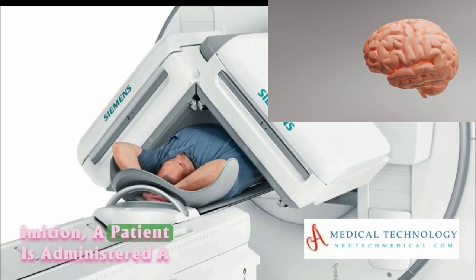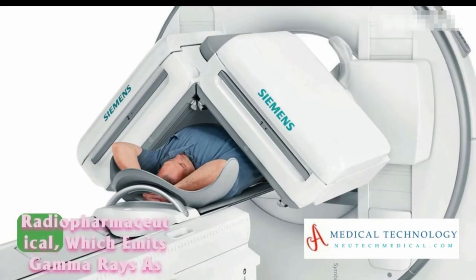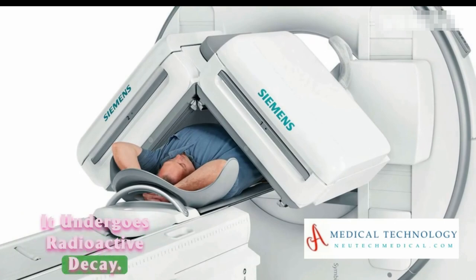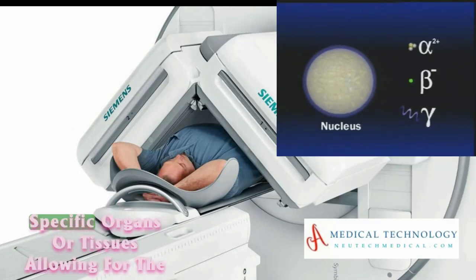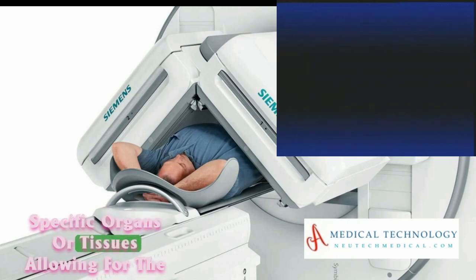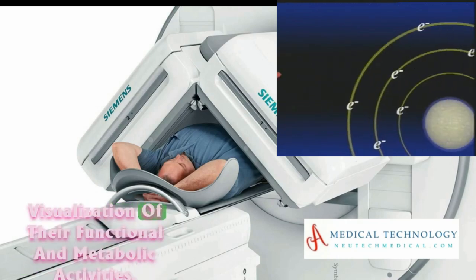Gamma ray emission: A patient is administered a radiopharmaceutical which emits gamma rays as it undergoes radioactive decay. The radiopharmaceutical is typically designed to target specific organs or tissues, allowing for the visualization of their functional and metabolic activities.